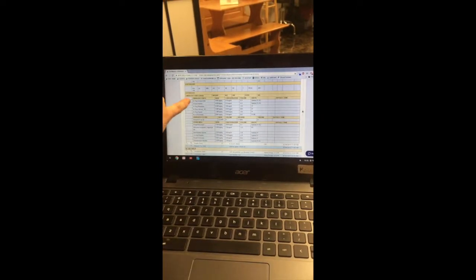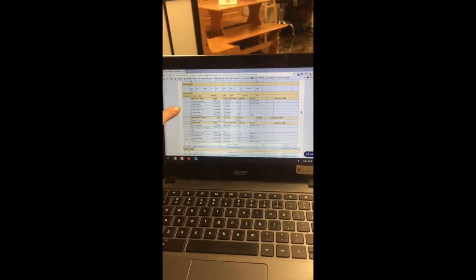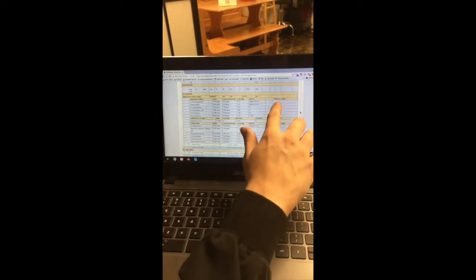If we were to scroll down, if she were to have an emergency, we have emergency doses that are already pre-calculated for all the drugs that we use in our clinic. So we have all those there, and if they are given, we can initial them off that they are given, and that is our anesthetic monitoring form.